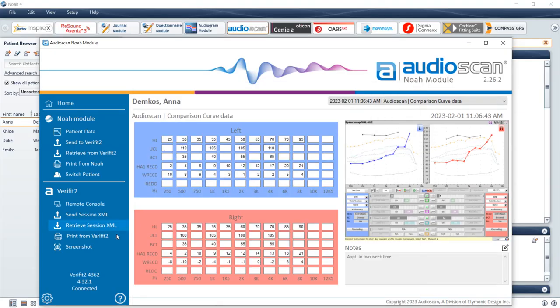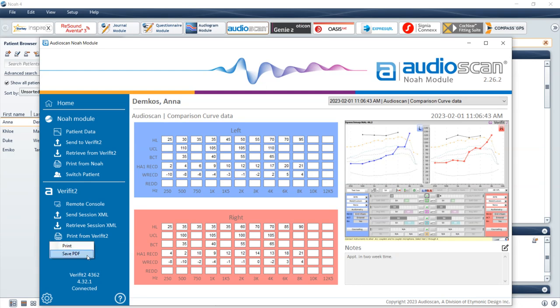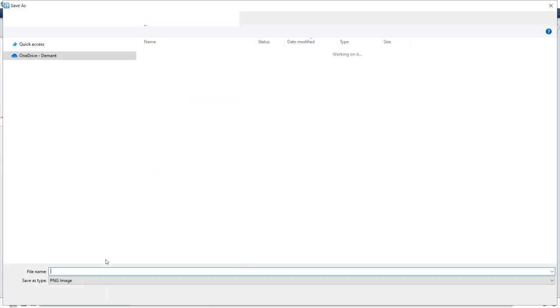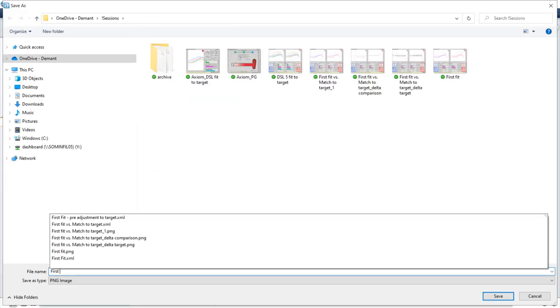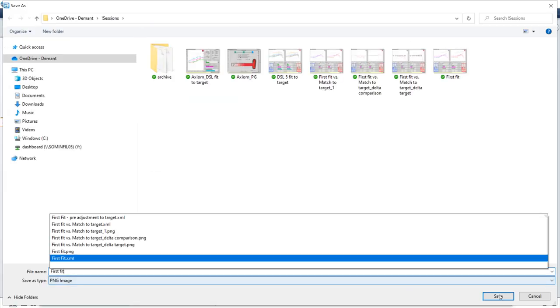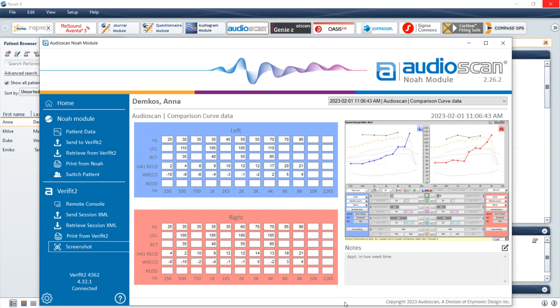Print from VeriFit2 generates an AudioScan equipment generated report. This is configured and set up under the Printing tab of the VeriFit2 or Axiom. To save a screenshot of your current AudioScan equipment screen, select the Screenshot button.